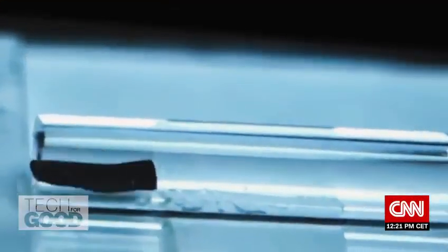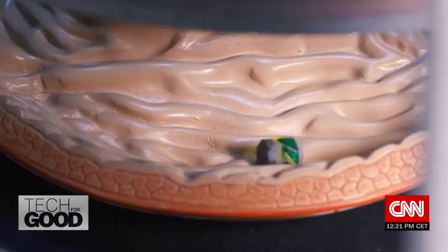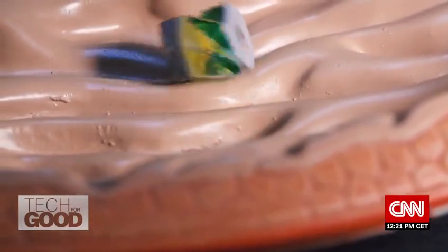While the possibilities for new forms of treatment are certainly intriguing, questions still remain. First, how will doctors remove the robot from the body once it's finished its task? Zhao says her lab is looking into it. One way is to develop biodegradable material that is biocompatible — it's very safe — and the robot can degrade after it finishes all the tasks.